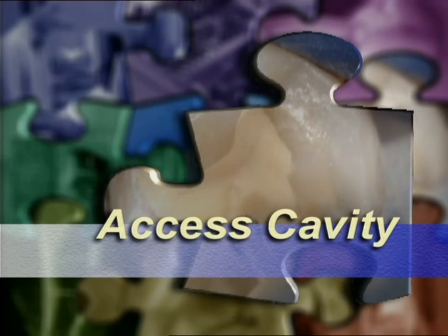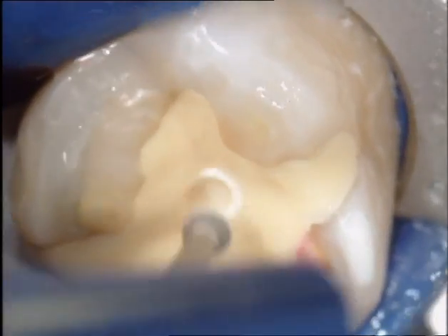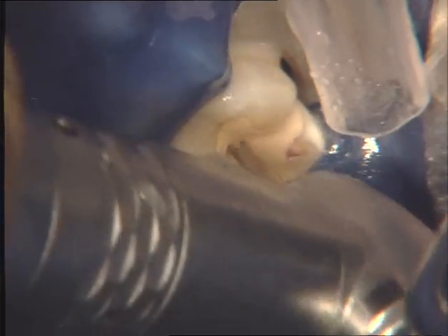The aim of the endodontic access cavity is to create a straight line access to the canal entrance. Old filling material and caries have to be removed. Sometimes it's necessary to build up the tooth first. A specific preparation kit is recommended.